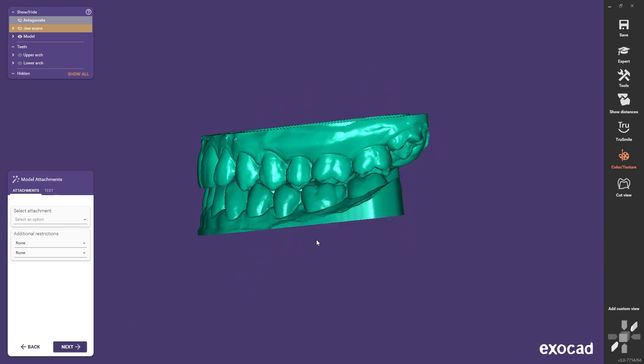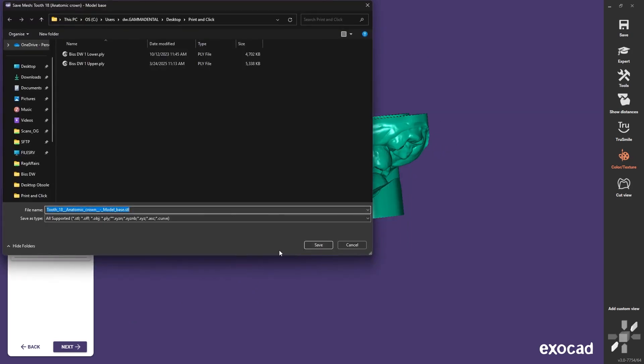It's important to save the printable models before finishing the workflow to keep the relations of the models. For that, right-click the model and select Save to File. After entering the file name and pressing Save, select relative to original scan data.